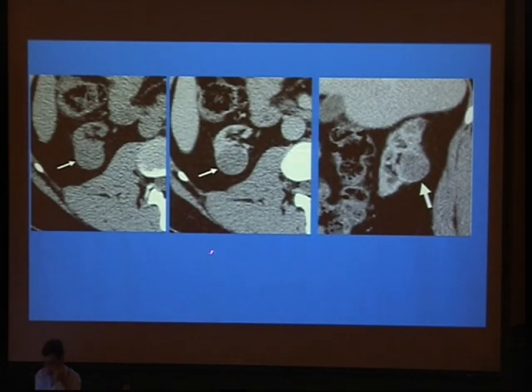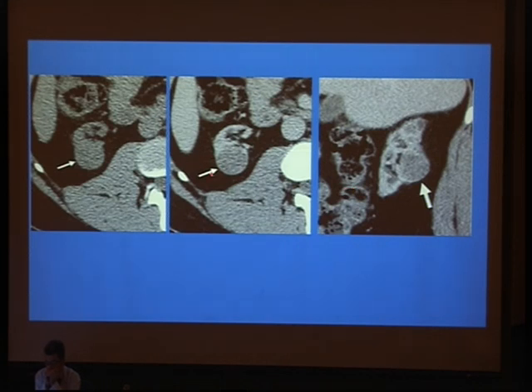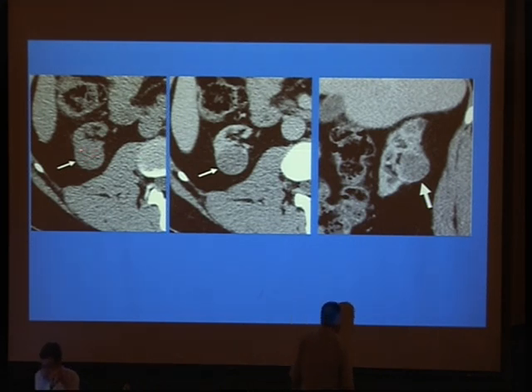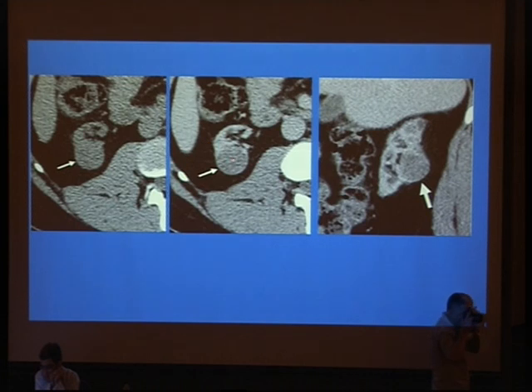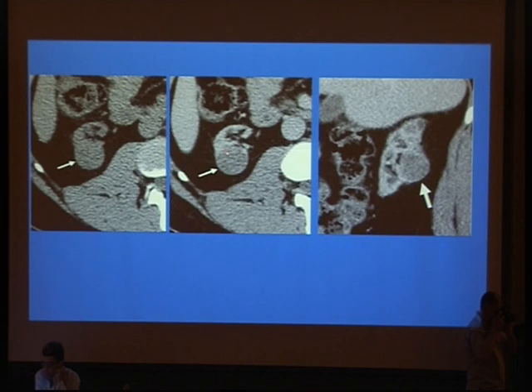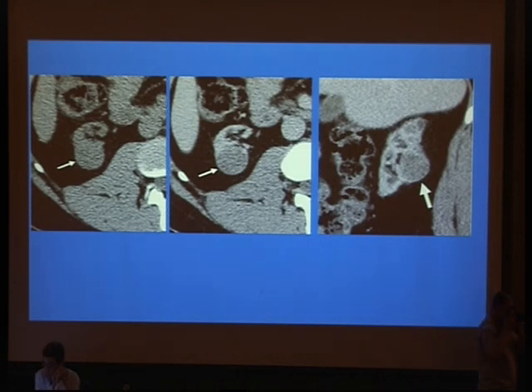What about renal carcinoma imaging? The CT appearance of renal carcinoma will be as in general renal carcinoma. Here we can see a small kidney in a patient with chronic renal impairment, and this is a lesion relatively isolated to the native parenchyma, with mild contrast enhancement after contrast injection on axial and sagittal images. Routine ultrasound allows early detection, and early detection will improve patient management.